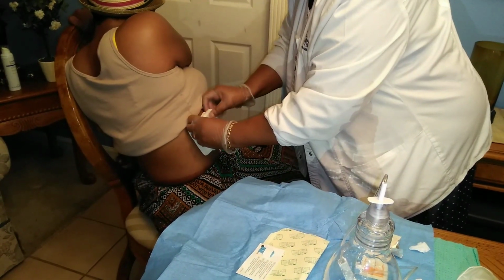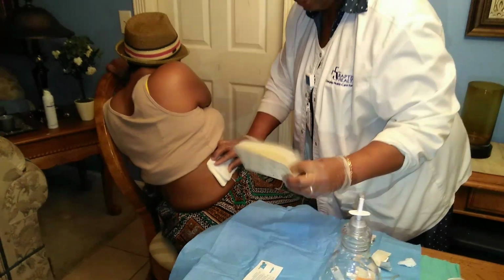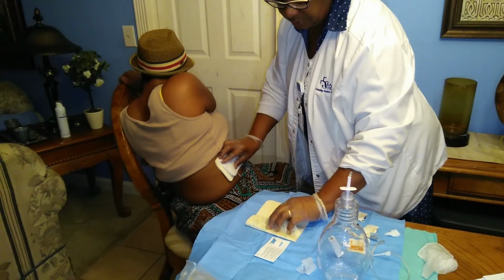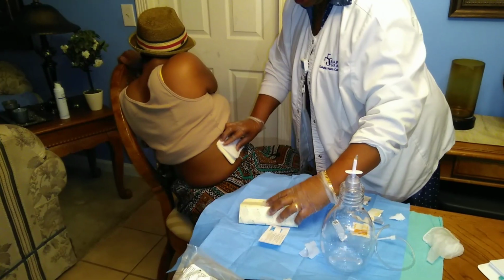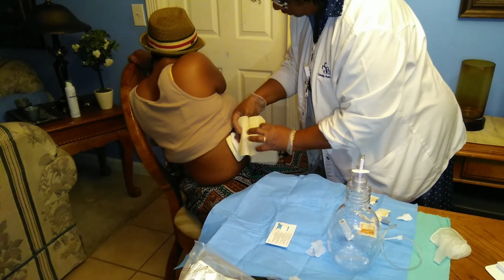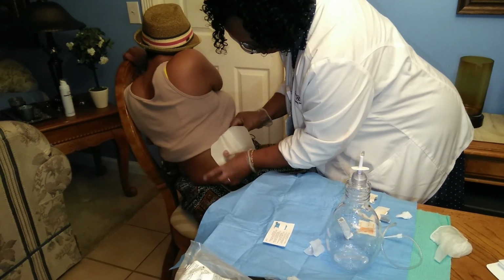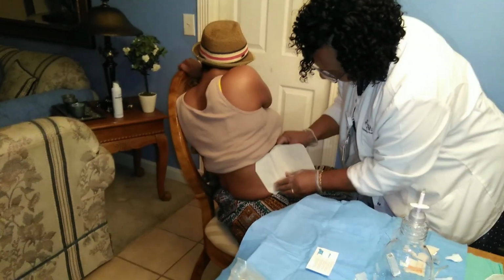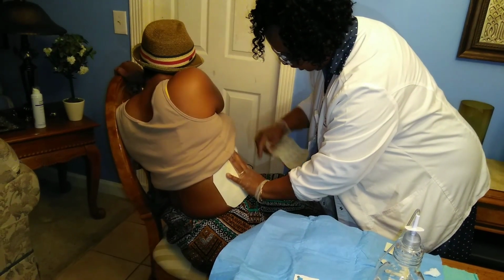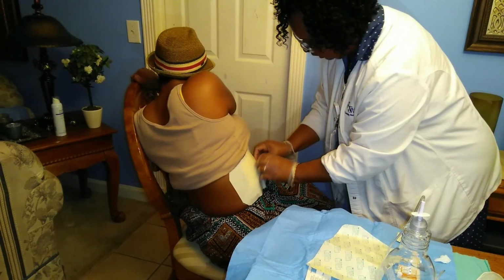I cover it up with a 4x4. And I secure it with my Tegaderm. And again, the secret to using the Tegaderm successfully is to fold it into thirds, like so. And if you take that third that you fold back, put that right on top of the end of that dressing, secure it to the patient. And you will enclose the whole catheter because that's the key. And then this comes off.